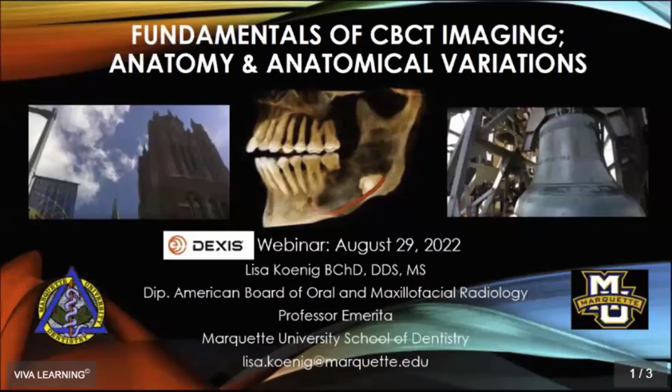What is our responsibility to diagnose pathology outside of the maxilla and mandible? Well, that's a very, very good question, and you have the responsibility. It's just like any other imaging modality. If you take an X-ray, you have the obligation to read it, which is why I would always advise that you take the smallest field of view you can to get the diagnostic information that you need, because that does limit your liability.